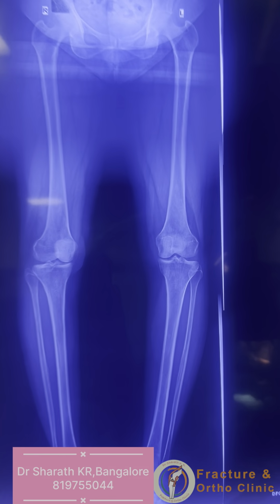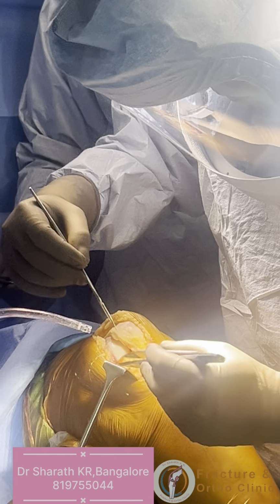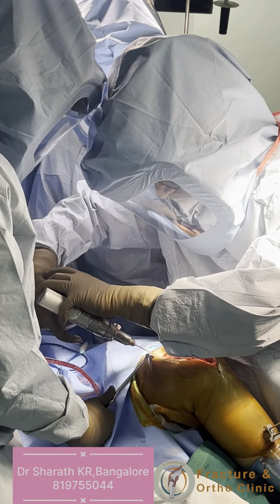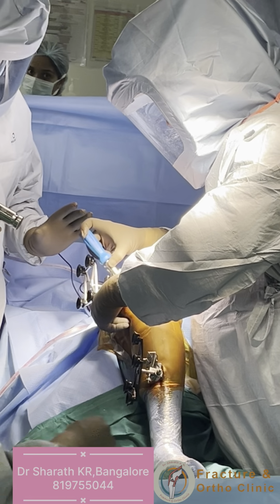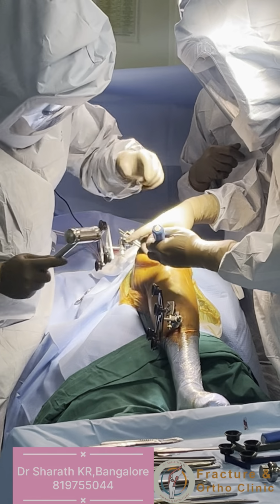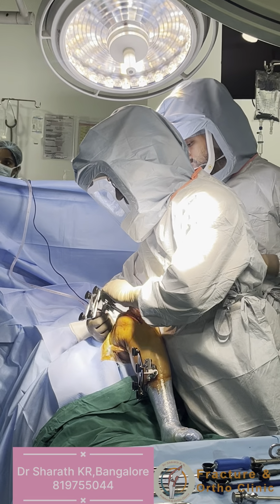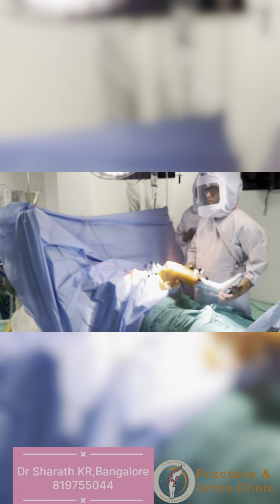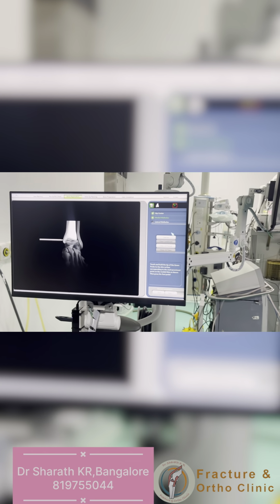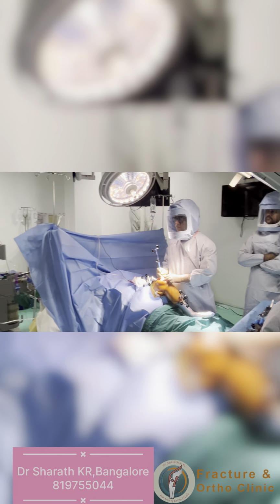I am demonstrating partial knee replacement surgery using the MAKO Robotic system. Here is the patient, a 52-year-old female who comes with medial knee pain, and X-ray confirms that medial osteoarthritis is seen. This pain has been there for the last 5 years, and the knee wear and tear is only seen in the inner part of the knee. After we mount the pins and trackers, we will then take the data.